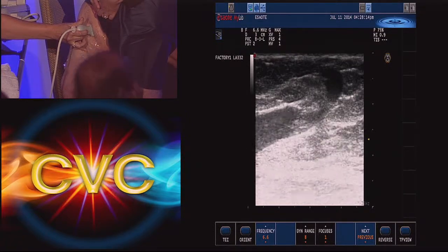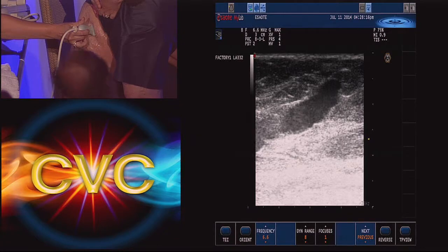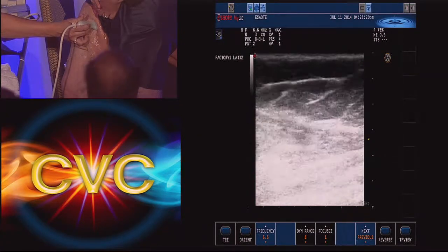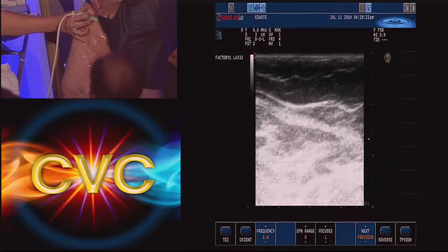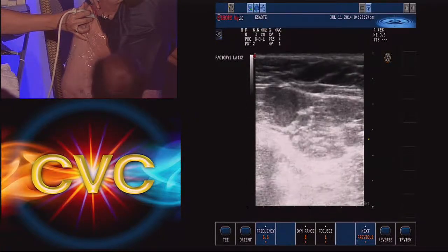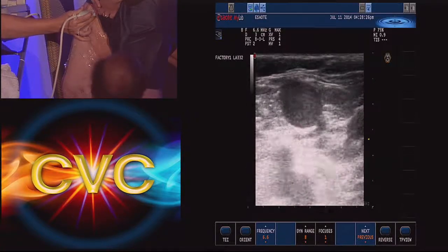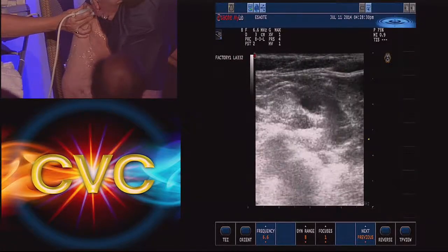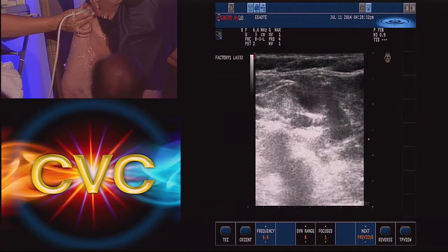That's an anterior accessory, right? Yes, it's right. The anterolateral branch. And that's what you want to foam. Well, first thing is you've got to take care of where the incompetence is. The incompetence is right here. So now if you look at where, and it's a very short distance. This is one of the tricky ones. If you're just starting, this is not your first case.